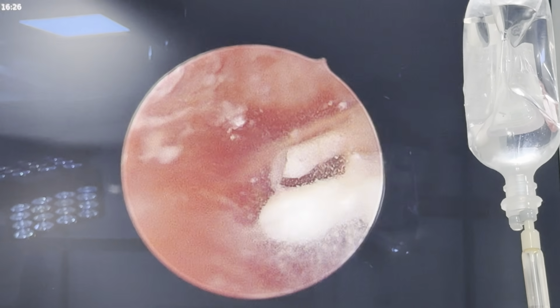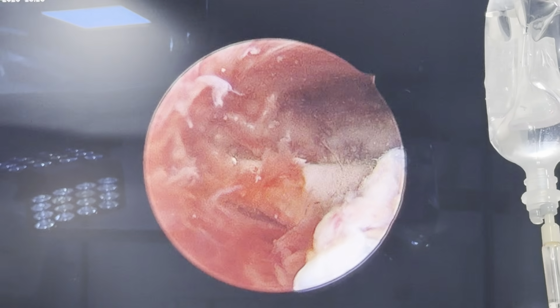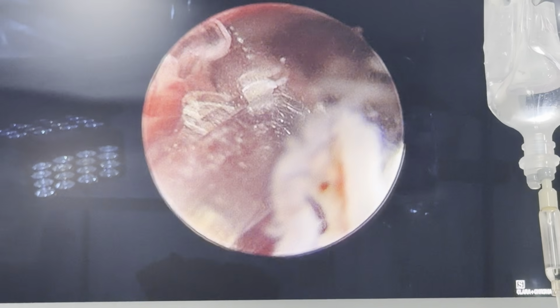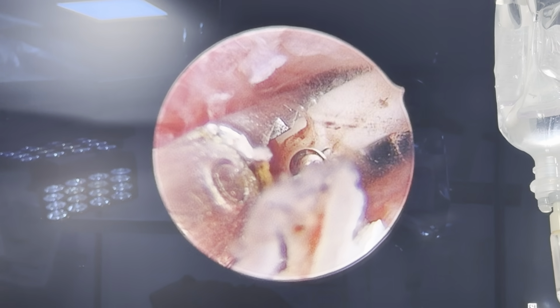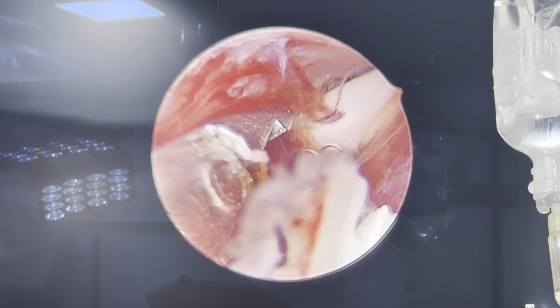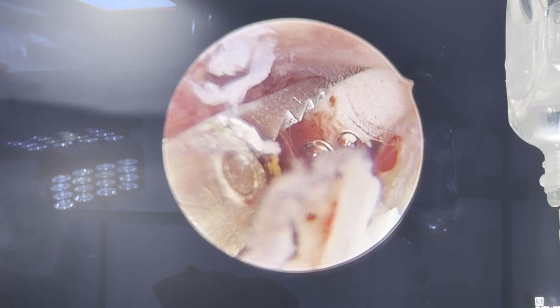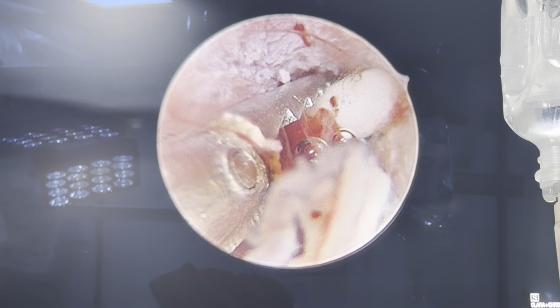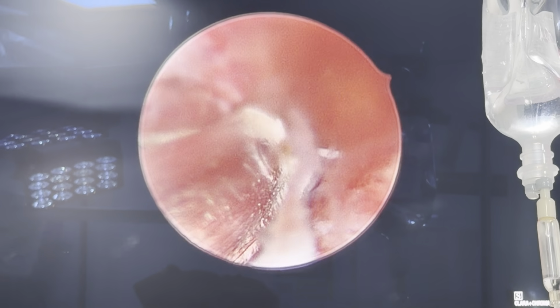Once I was sure that the IUCD was separate from the myometrium, I decided to put a grasper and grab the proximal most limb of the IUCD. Once I had a good grip on the limb, I asked my technician to not give any more pressure and I slowly removed the IUCD out. I'm using a 2.9 mm hysteroscope without any cervical dilatation.